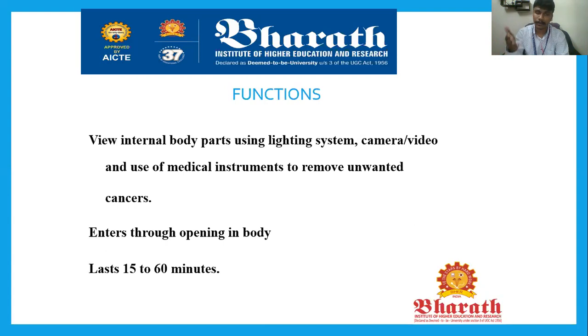Proceeding with endoscopy without any surgical procedure means without any cut or coagulation in the human body. By inserting the endoscope and then a surgery knife, cutting the cancer cell or the infected cell and removing it from the human body. This is known as endosurgery.